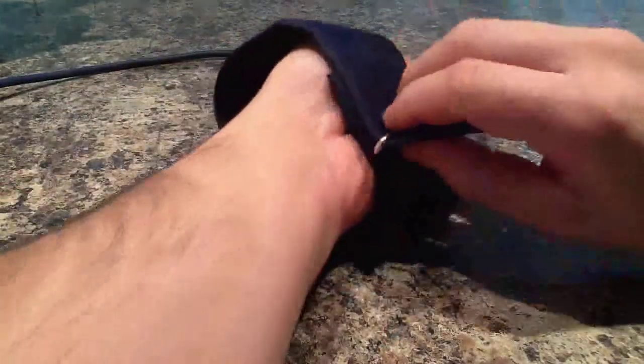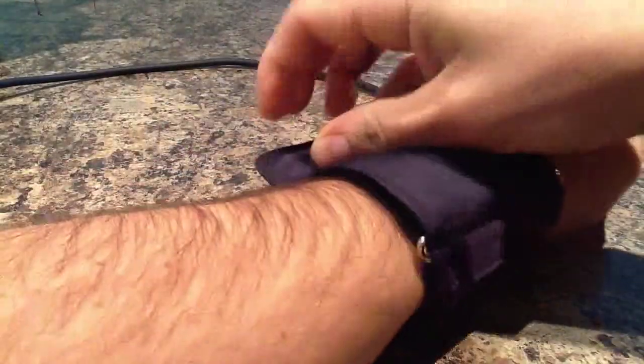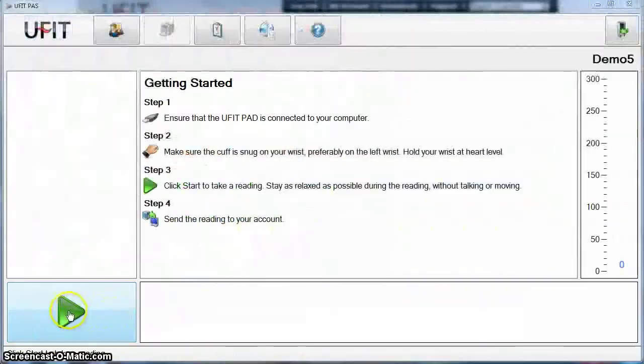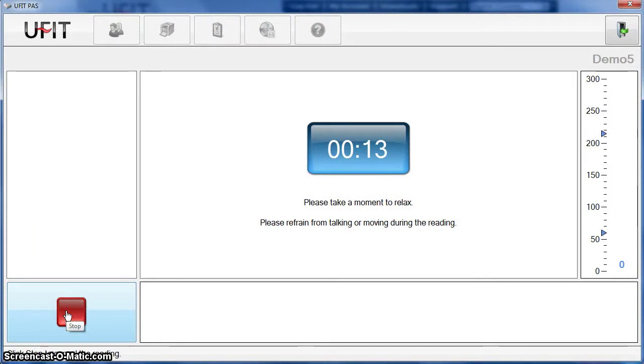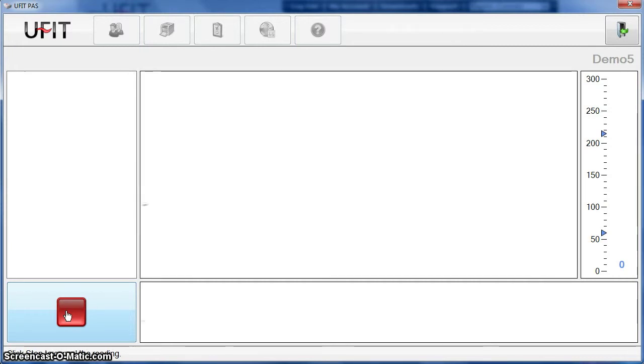First, you put on the cuff. Keep your arm at heart level and click on the green start button. A timer appears, so take a moment to relax with a deep breath. For best results, don't talk or move during the reading. The cuff inflates, and you can watch your heartbeat on the screen.